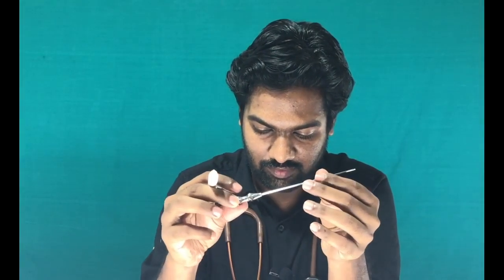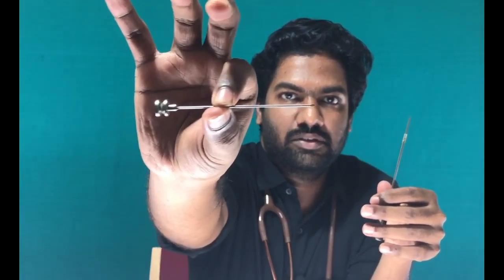Now you can see this Vim-Silverman liver biopsy needle. Let me compare it with the earlier needle. The earlier needle was stout, one solid thing. But if I remove this, this is the Vim-Silverman needle. Now you can see that it is bifid, or pronged.